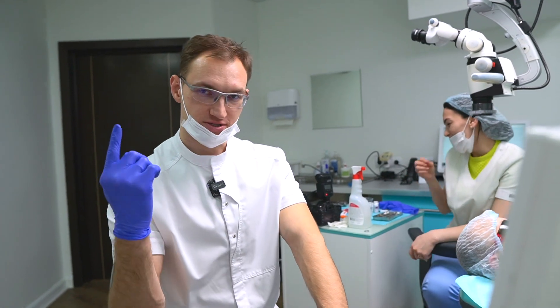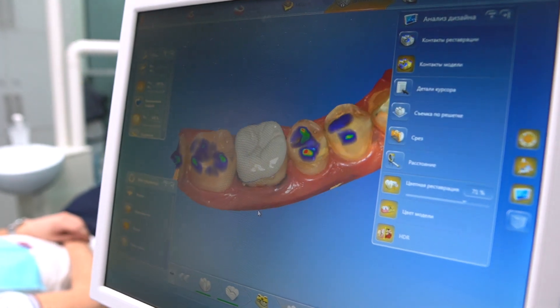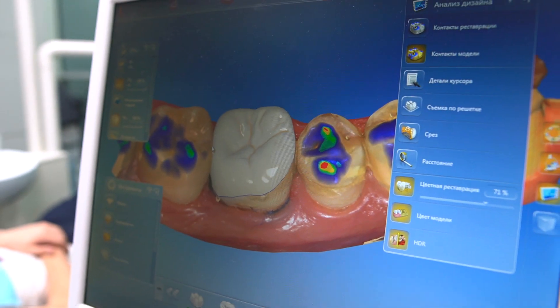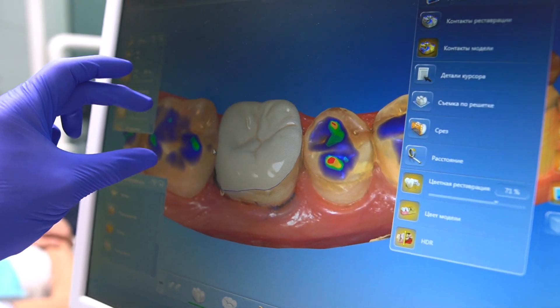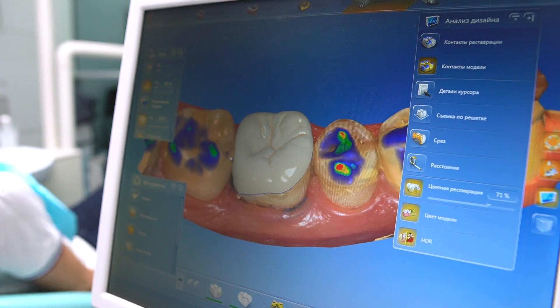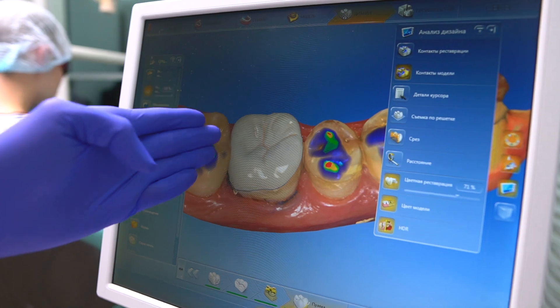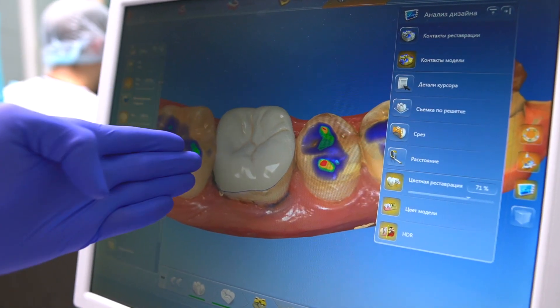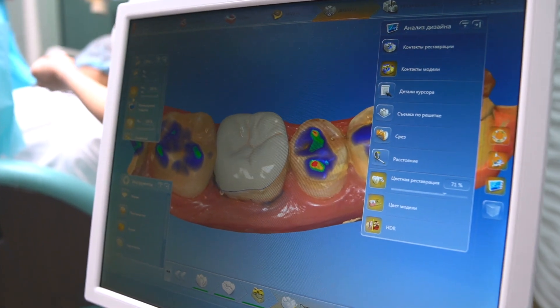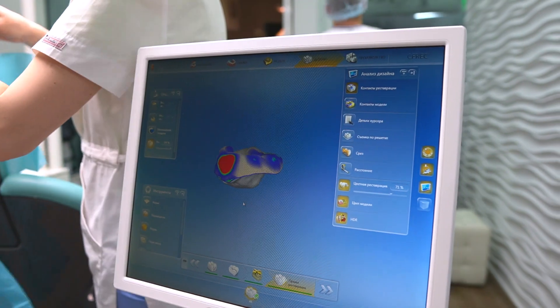Our restoration is ready. You can see it — lower jaw, one restoration in 3D. It is an overlay. We have some problem here because tooth number 4.7 moved a little bit, due to, I think, 4 or 5 years. And now we have a problem — I have to cut a little bit the surface of tooth number 4.7 and cut a little bit the surface on tooth number 4.6, as there are extra contacts between these teeth.